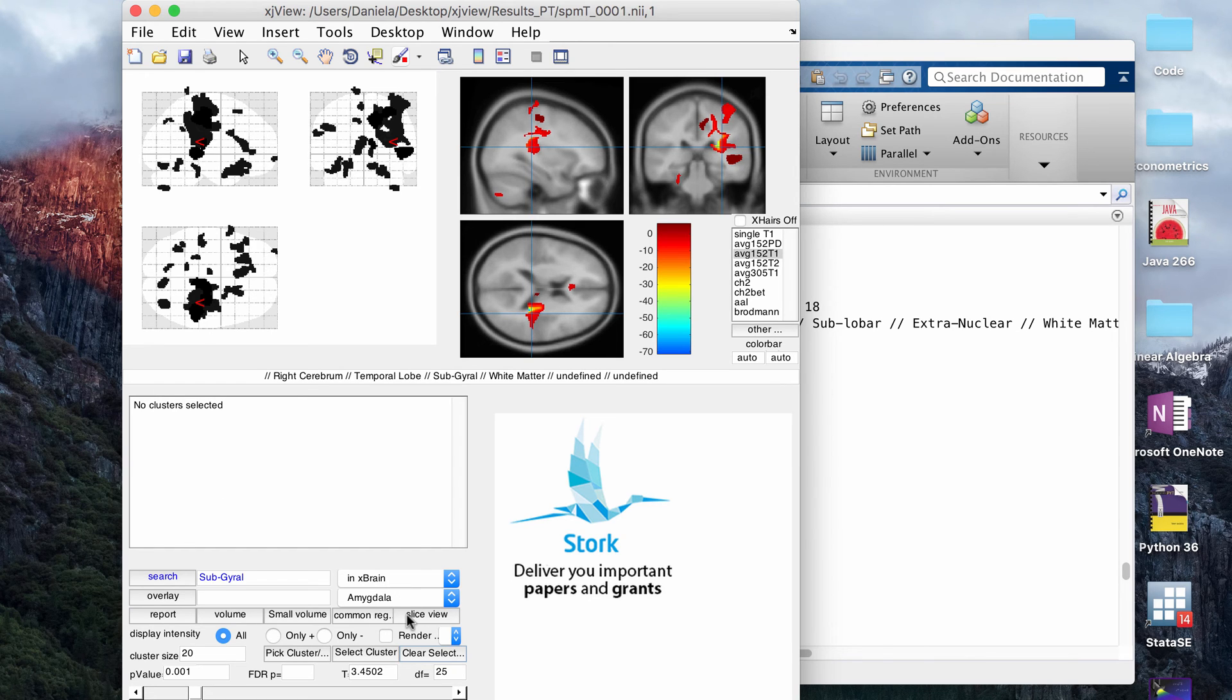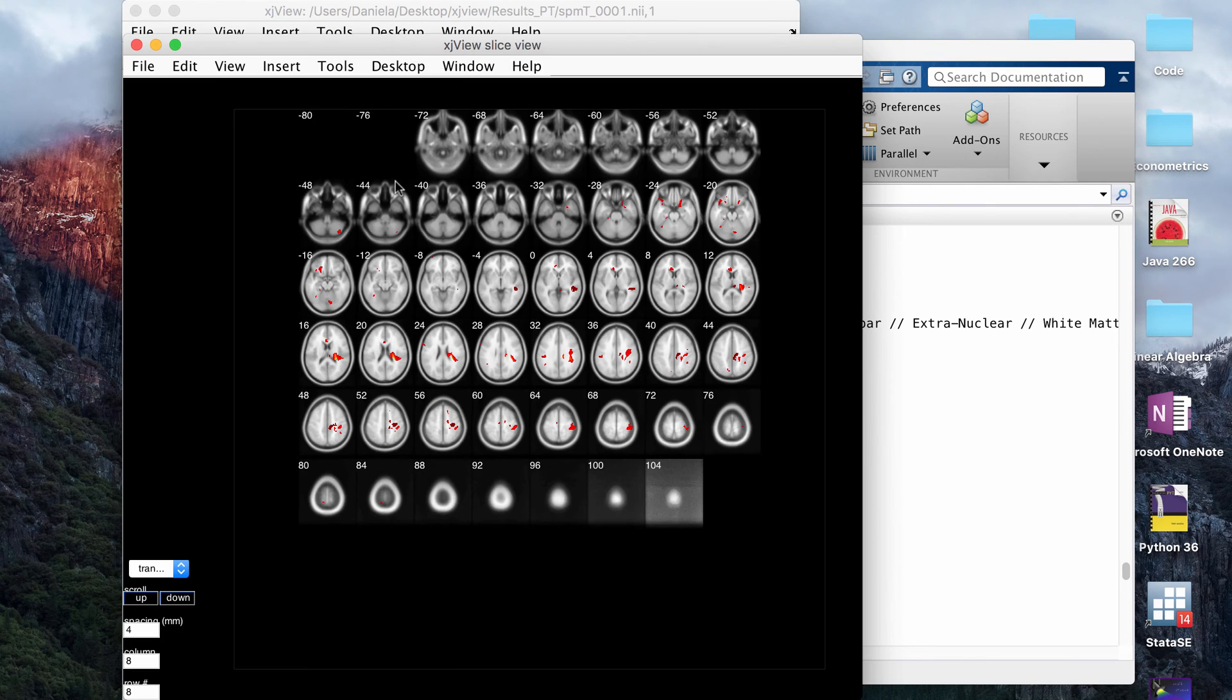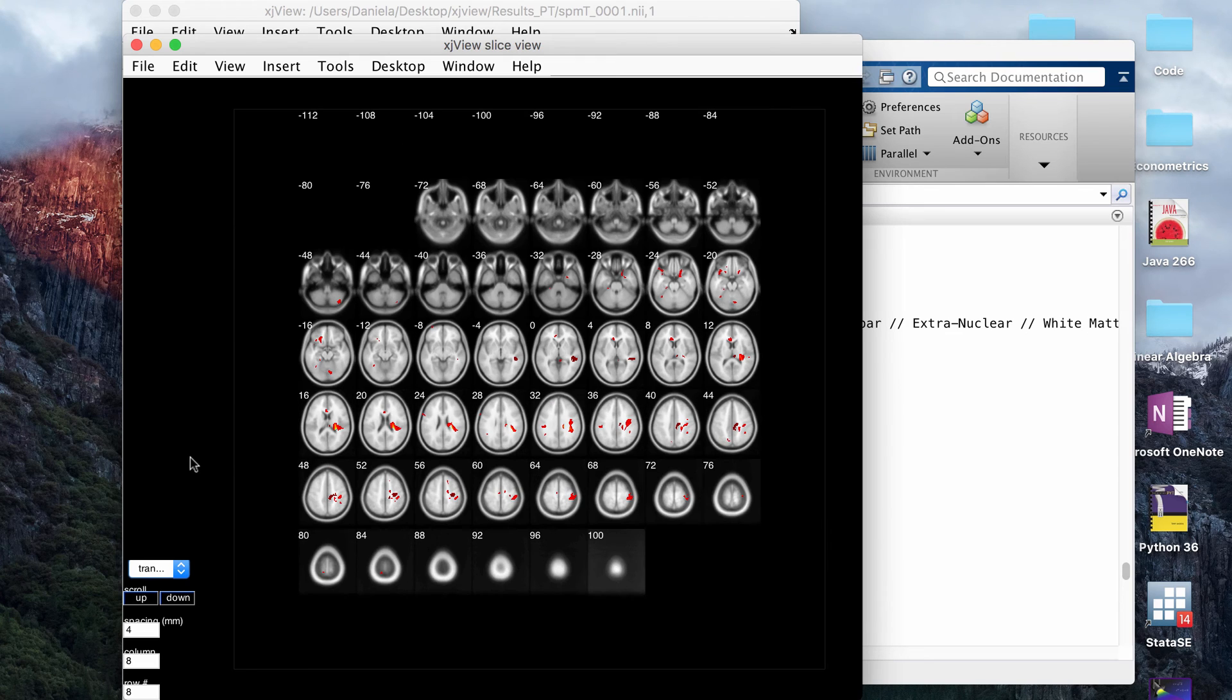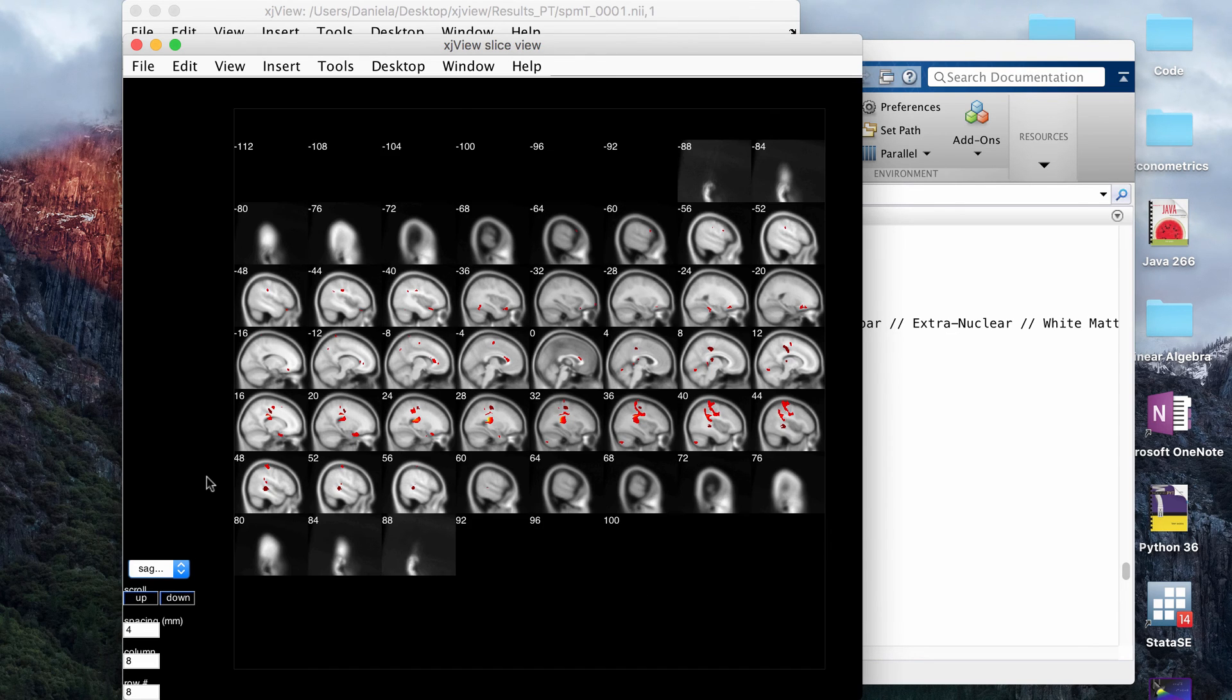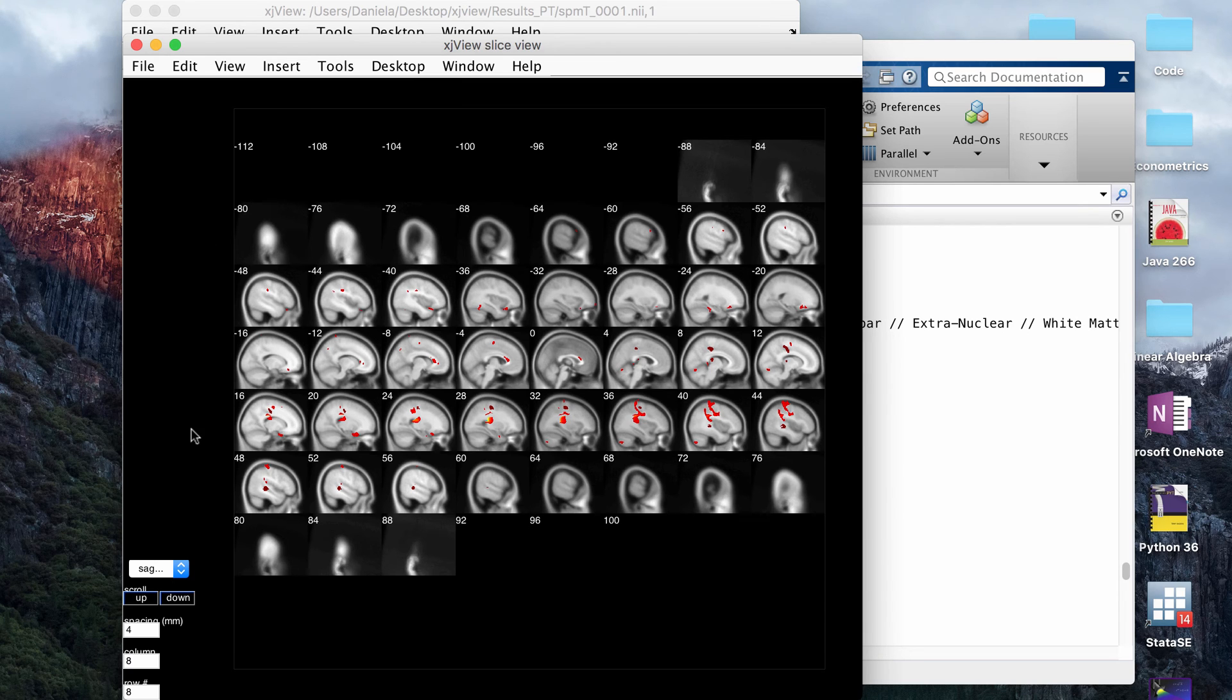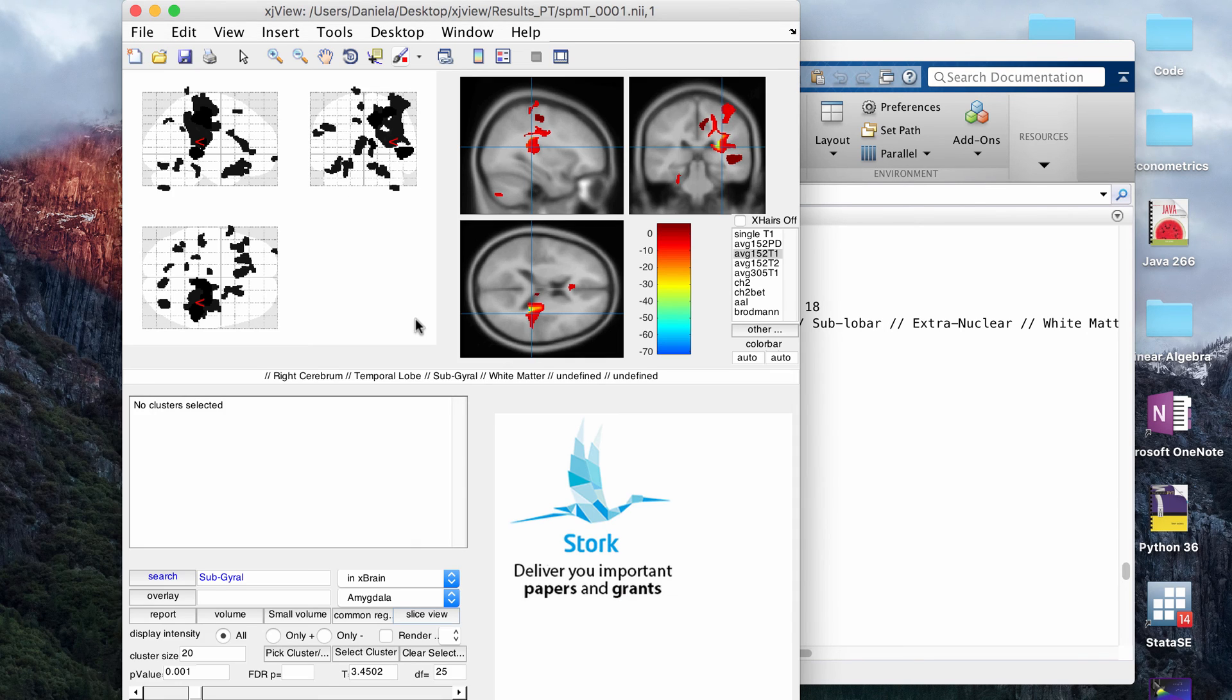Another thing that's really useful is this slice view. This will open a window that will show various slices, and you can view it in the coronal, sagittal, or transverse planes, so that's really useful. I use that sometimes if I'm trying to see if a cluster really is significant to see how many slices it will go through. As you can see here, you can visualize the schizencephaly pretty nicely on the sagittal view, but maybe on the transverse, you can't really appreciate it as much. That's another useful button.